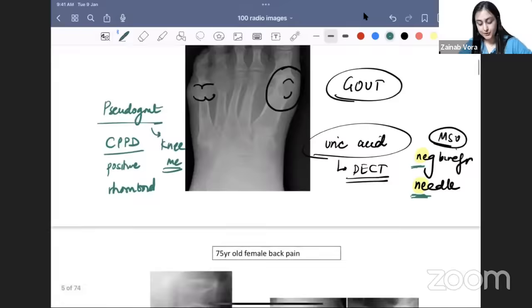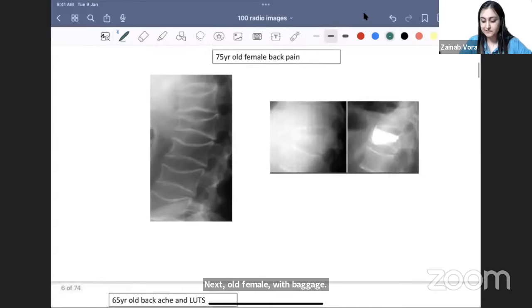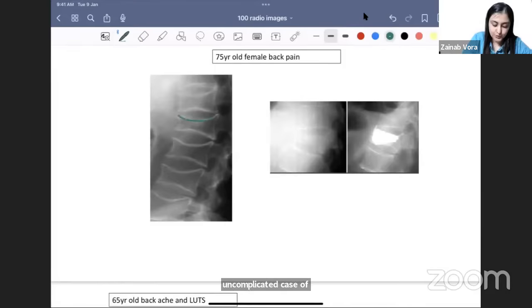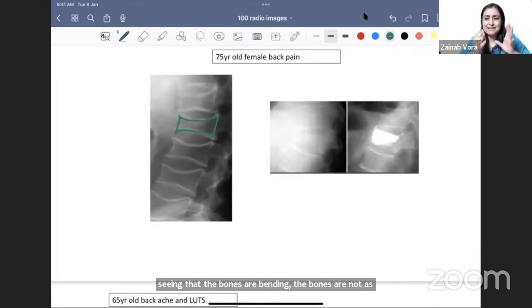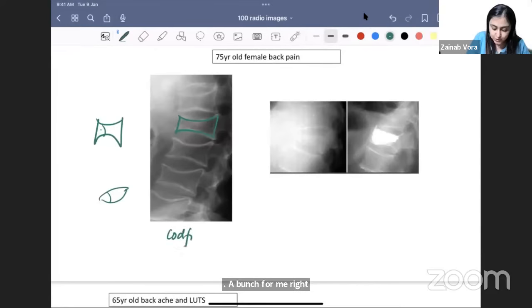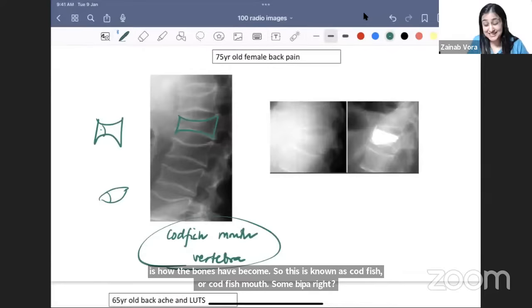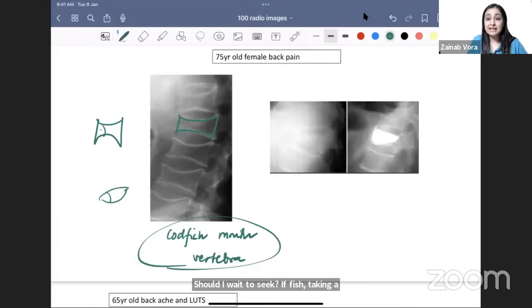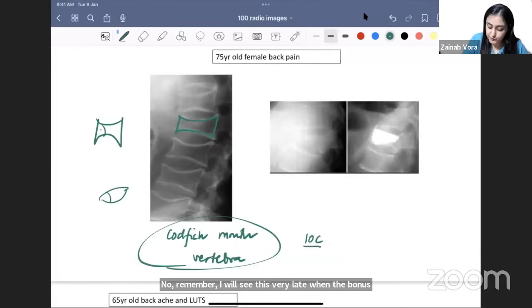Next: old female with backache. Showing three kinds of X-rays. In the first, uncomplicated osteoporosis — bones are not as white as they should be, bone density is reduced, and because they are very weak they can't hold the axial load, becoming deformed. This is known as codfish vertebrae. However, X-ray is not sensitive — you see this very late, when the bone has already lost almost 40% of its density.